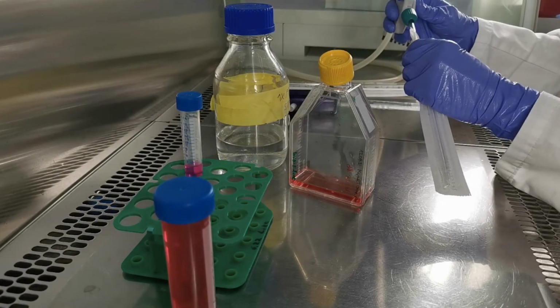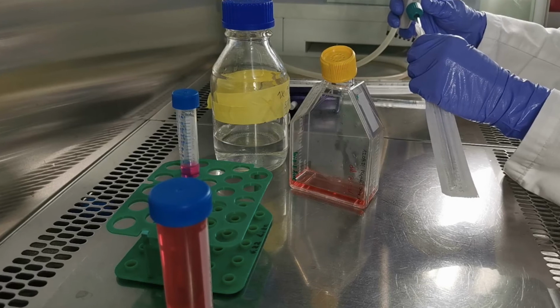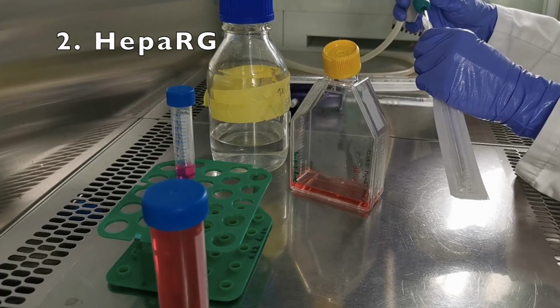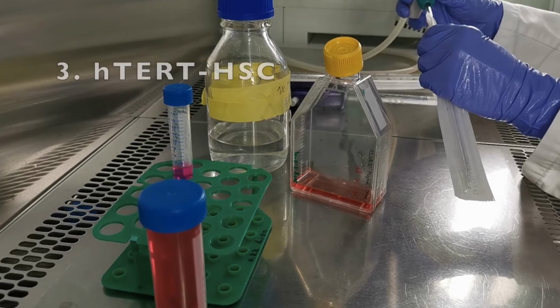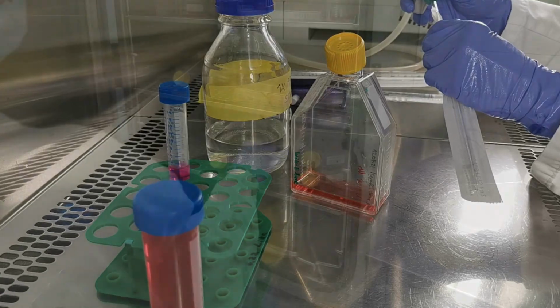The same trypsinization procedure will be performed for the HepaRG and the stellate cells. The HepaRG will be trypsinized second, as they are the second fastest to detach from the flask, and then the stellate cells will be trypsinized last, as these detach the quickest.